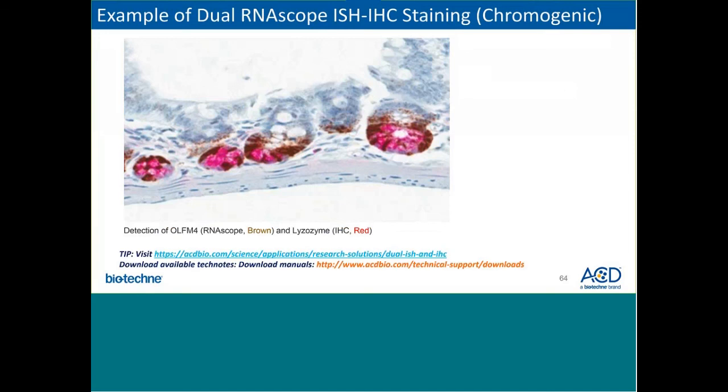Here is one example of using the RNAscope singleplex brown assay to detect the OLFM4 probe with subsequent IHC staining in red for lysozyme.